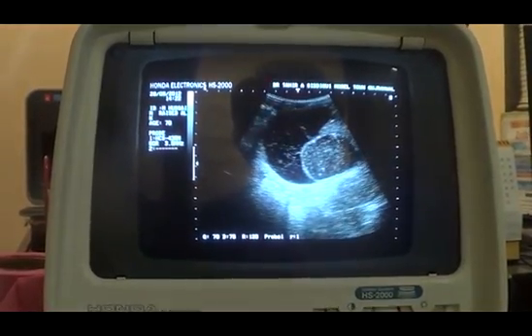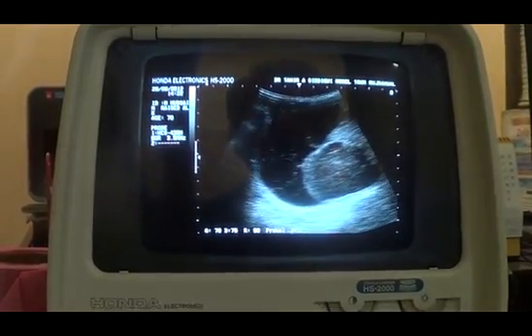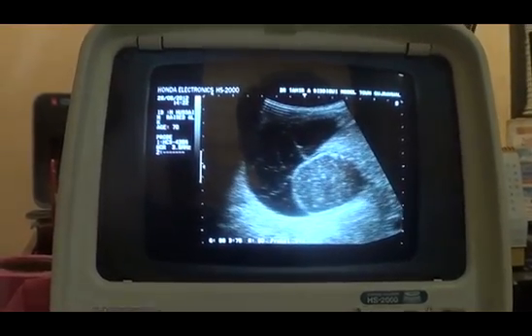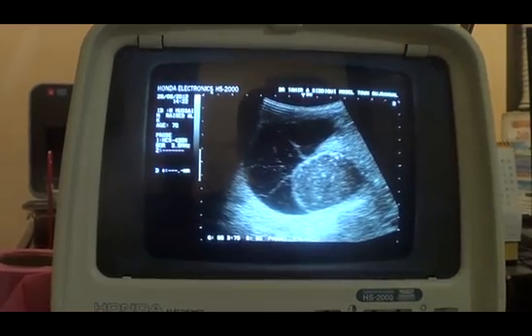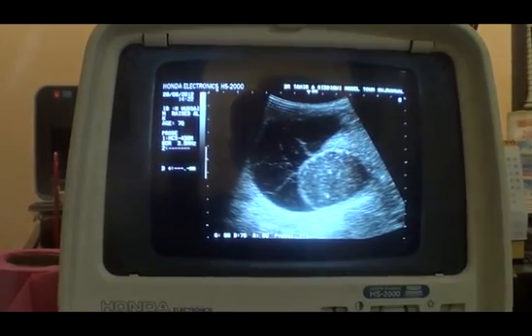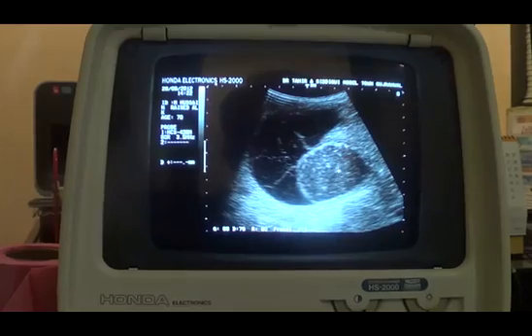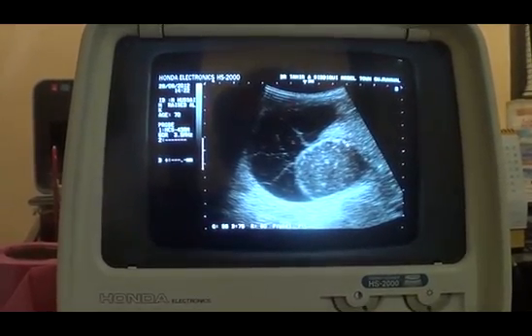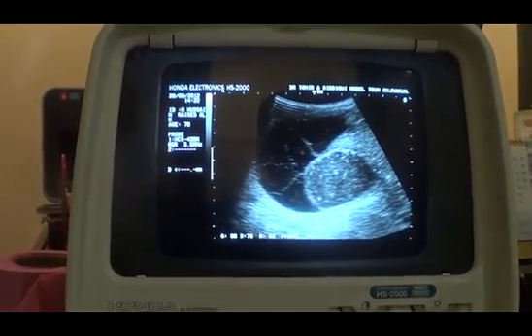You can see that this area that I am saying is the gallbladder is filled with, now these are cholesterol calculi, these tiny ones. These are cholesterol calculi, the reason being that they are giving a short comet tail artifact. This is a short comet tail artifact. This is an artifact. Now this is a loculated fluid pocket around this gallbladder.